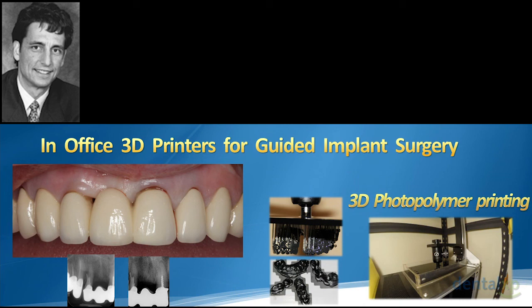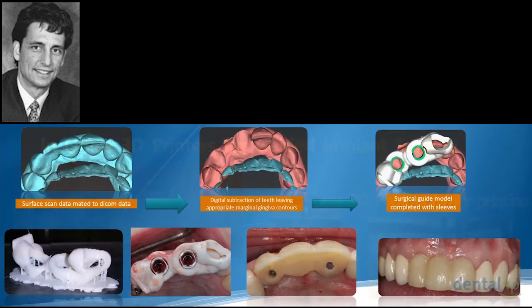But what it allows us to do is take care of every step in the office, from the planning to the ultimate printing, which I think, if you look into the future with the way digital dentistry is moving, there's more and more of a trend to doing things in office. While we like to utilize the assistance of our laboratory technicians, there are certain steps that can be expedited. One of the challenges that I have found in the guided surgery arena is that with some of these tougher cases, you're waiting 3-4 weeks to get your guided surgery case completed when you're utilizing some of the labs. And if the patient wants to do it tomorrow, you can stay up late and take care of this all within your own office.